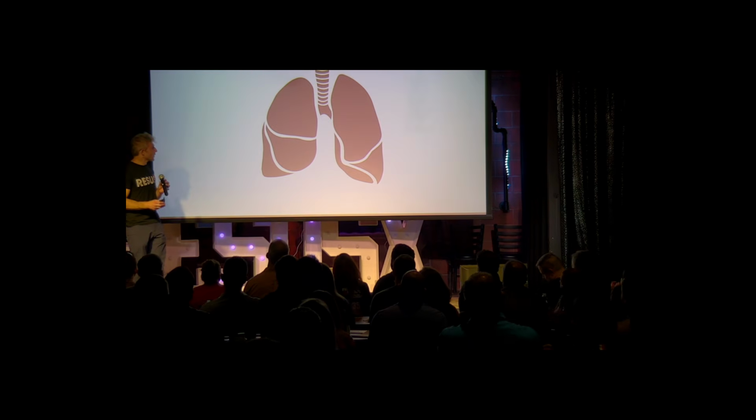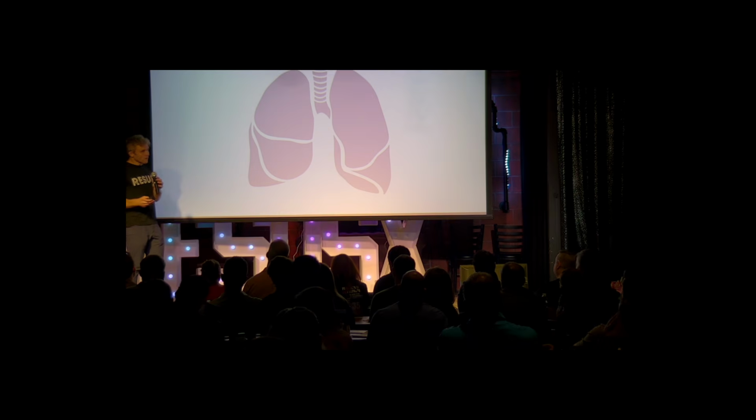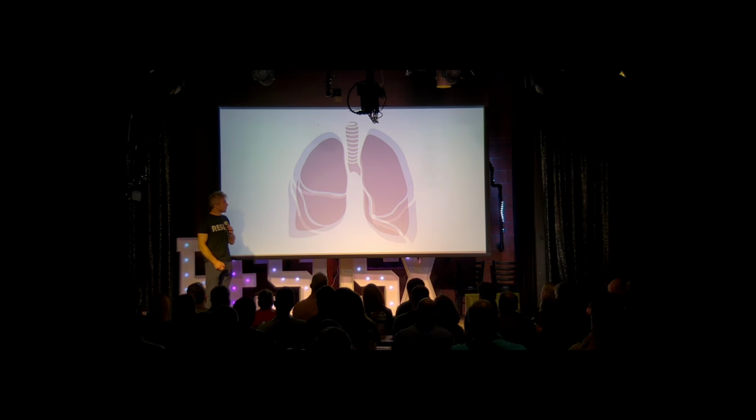And to do this, I think we have to get back to that idea of what are you really trying to do with driving pressure, plateau pressure, so on and so forth, which essentially answer the question is, how much volume do you have to give a patient to safely ventilate them? And what your goal is essentially what is the tidal volume that is appropriate for the size of the patient's lungs in front of you, right? Because what you don't want to do is give them a volume that's too big for the lungs, leads to more damage, ARDS, so on and so forth.